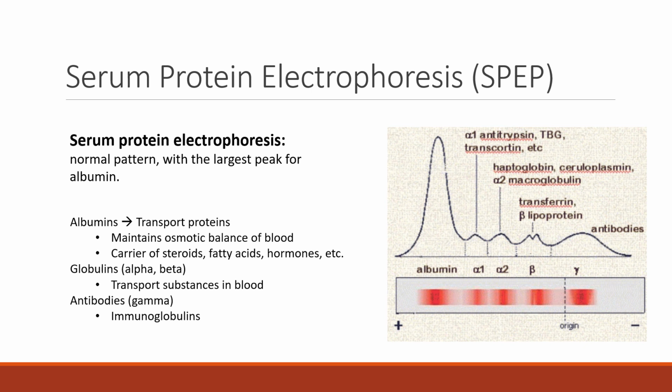So serum is the liquid part of our blood that's found once we separate it from the red blood cells, white blood cells, and platelets. A serum protein electrophoresis, or an SPEP, is a clinical laboratory technique that's used to determine the levels of some types of proteins in our blood sample. A doctor might order this to help diagnose or monitor a variety of different diseases or disorders that will affect these particular proteins. One of them is the albumin protein.